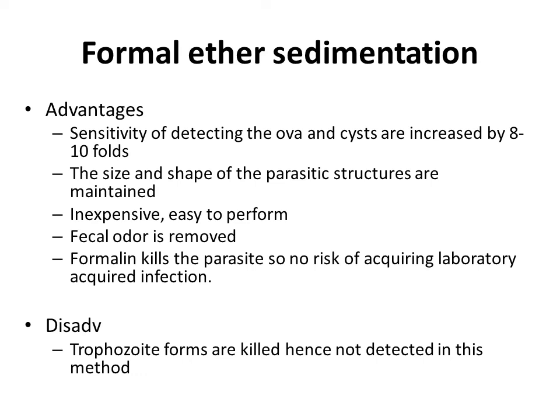Disadvantage of this method: when we use formal ether, the trophozoites are killed, because trophozoites are very delicate organisms. So formalin kills the trophozoite stages.